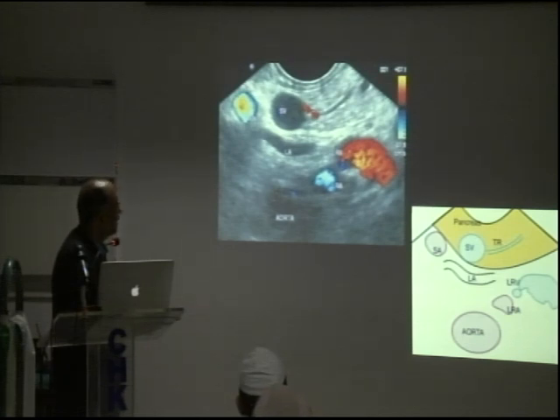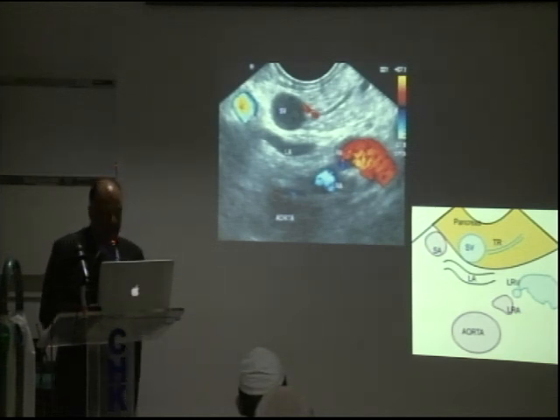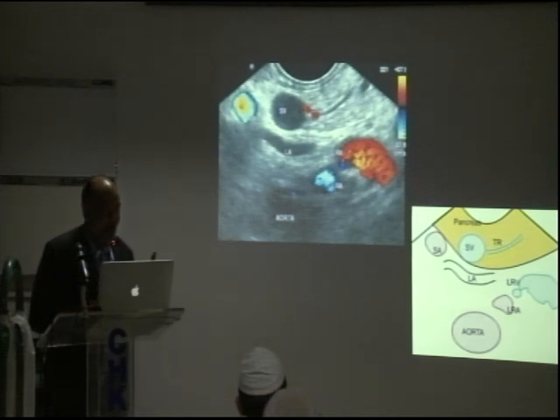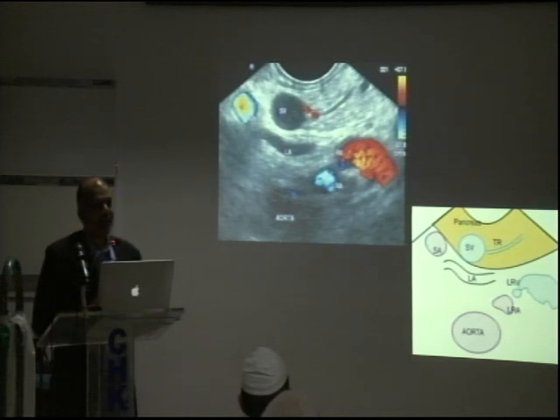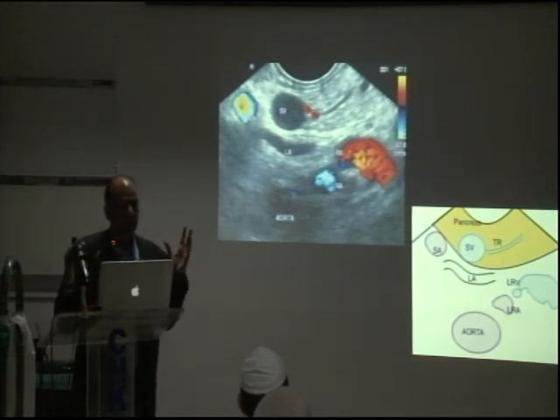Yeah, you've got a translucent area. But look at the pancreas going from here up to here. You have this splenic artery here, and the left renal vein also coming up here, the left renal artery coming up here also. So this is actually a radial scan, just to give you an idea. So what I'm saying is, identify the structures and try to make out a picture from there. And if you just change the template, it changes everything.